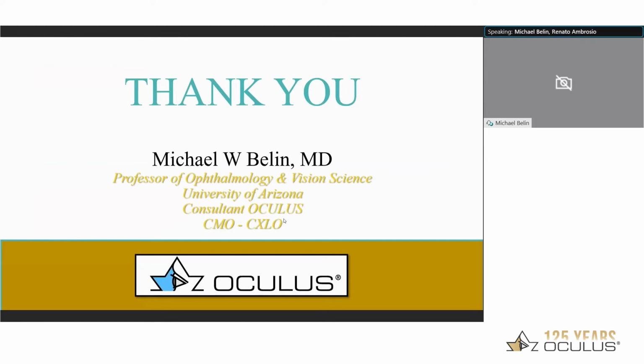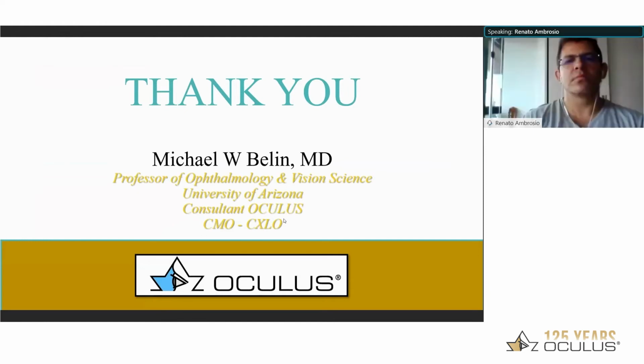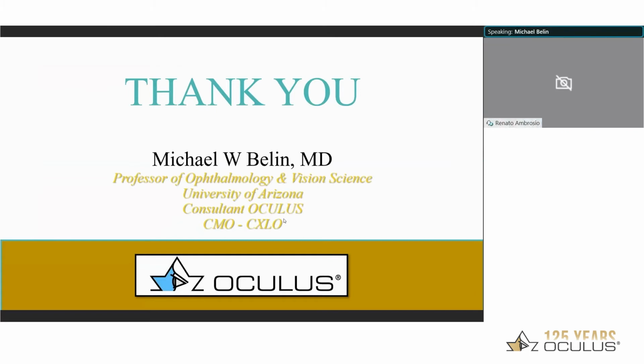In the US, we have fairly restricted insurance coverage that hopefully over time will change, and 95% of the insurance companies still are using 1 diopter of K-max. We are submitting tomographic data, and a lot of insurance companies now are recognizing that we can show change earlier. But again, that varies. It really varies too much by geographic region and by individual practice to give you a good answer to that.